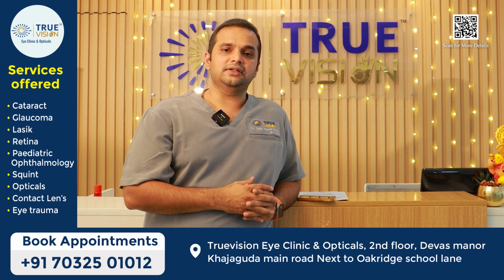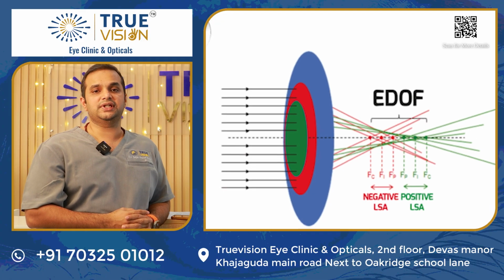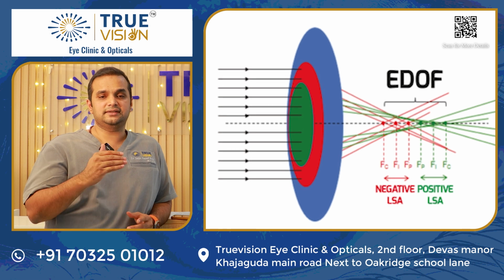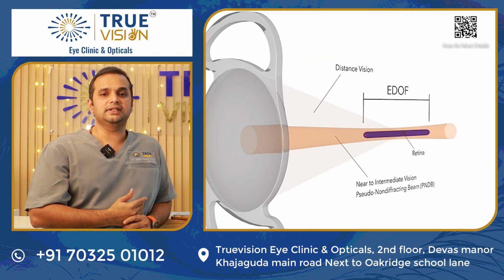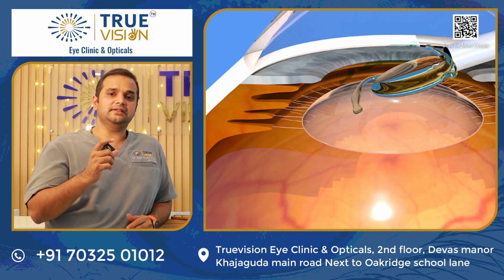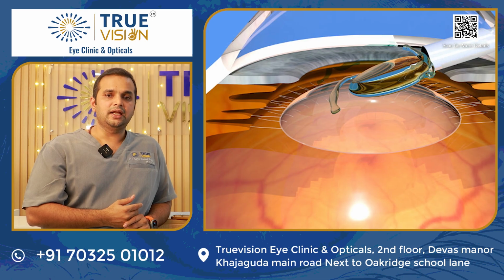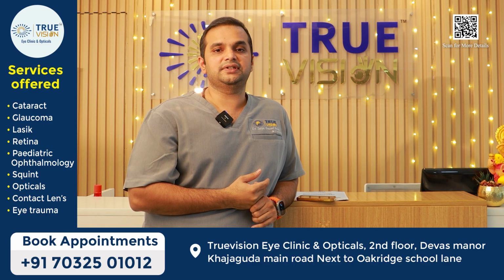Another lens, which is the latest again, is called the EDOF lens, which is the extended depth of focus lens. This particular lens is one step higher than monofocal and one step lower than the multifocal. In extended depth of focus, you won't need to wear glasses for your distant vision, but your near vision will be corrected up to 90 to 95% here.